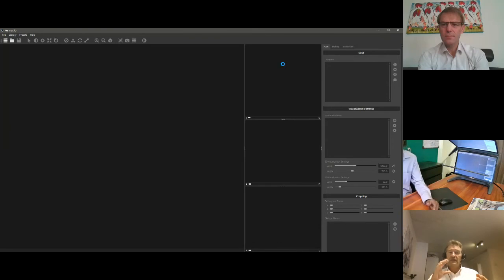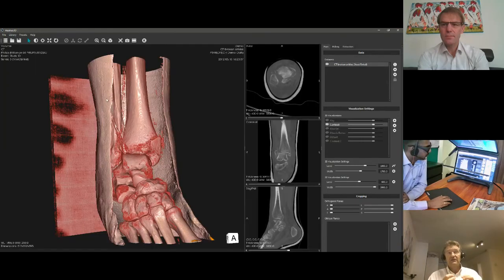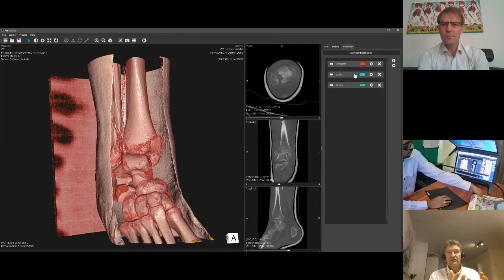And that's something which is important. It's important in group discussions where there are specialists from different sides of the table. For example, a radiologist is very good in flat images and understands the images because they're doing reconstructions in their head. But for example, surgeons are far more 3D oriented. They are doing surgery on a patient, which is by definition a 3D object. So if you have a complicated case and you need to discuss it among different types of specialists, then especially a 3D visualization is very helpful.